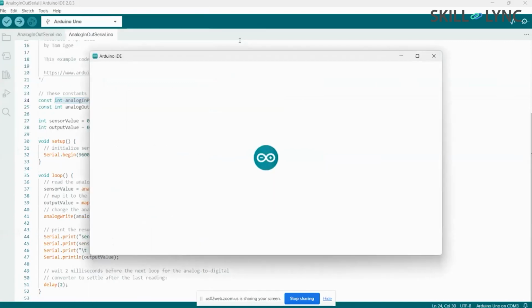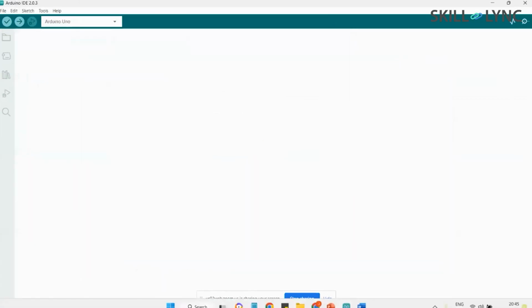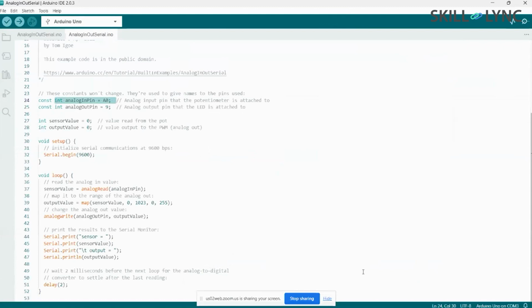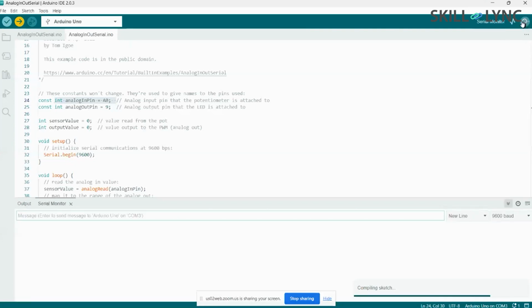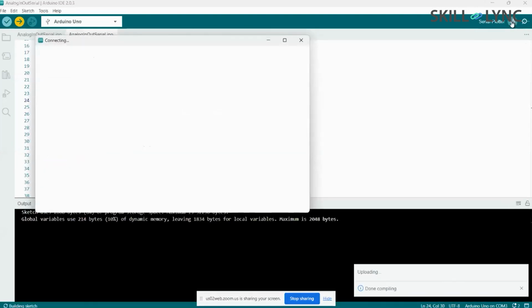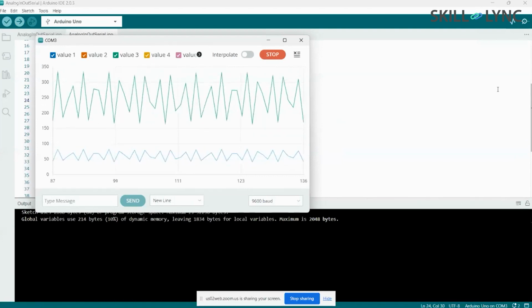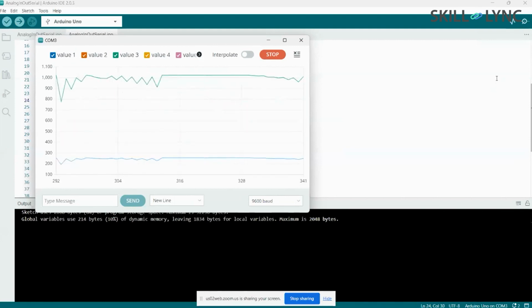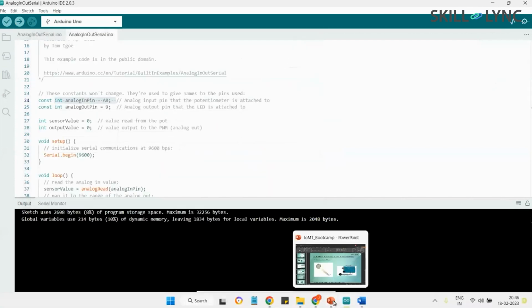I will show you both the things so that it will be easy for you. Just see whether some noise values are added and coming or not. You just try seeing it in your serial monitor. Is some value coming or not? See? Some kind of spikes. Don't think it is your output. It could be the noise added to it. Just by moving the sensor, see there is some kind of replication which is noted in the window. So this is for your general serial analog monitor, guys.